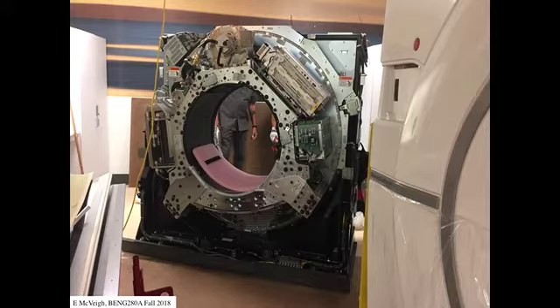So this is what that system looks like when it's being installed. This was installed here in April, maybe 2 years ago, something like that. So it's a hefty piece of equipment. All of this gear here is rotating at 280 milliseconds per 360 degrees. It is mechanically spec'd to rotate at 200 milliseconds.